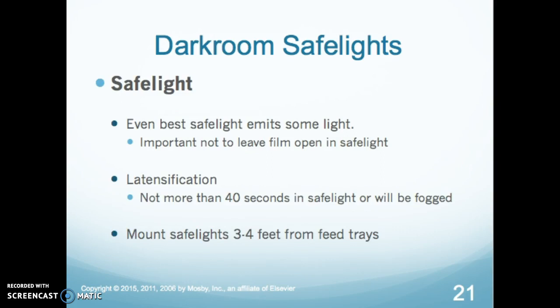So even the best safe light emits some light. We're going to talk about that in your 121 class. In the electromagnetic spectrum, light contains all colors. So a laser beam is the only one that contains just the one color. So even though we have what's called a safe light, it's important not to leave the film bin open for too long or leave your film out before you process it, because it will fog your film.